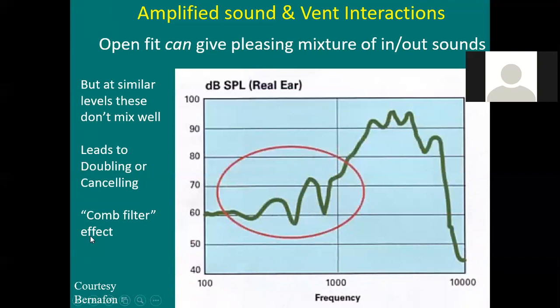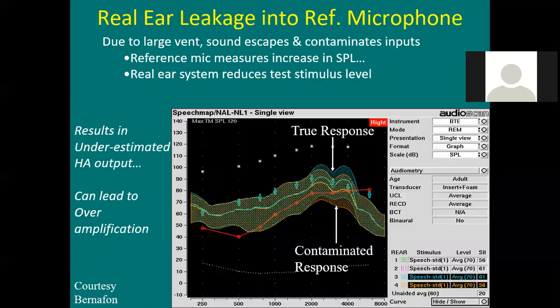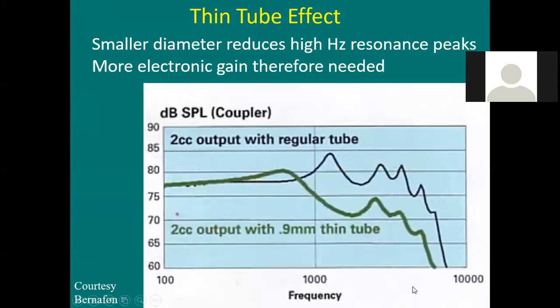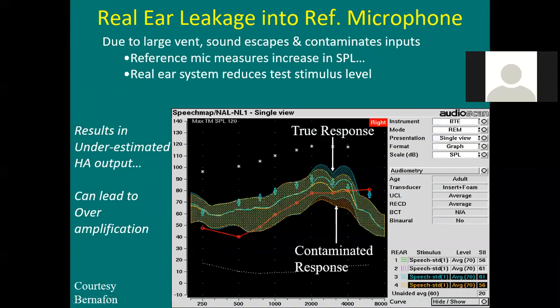And this can be a concern if you've got wide open vents. This is what one possible concern is. But when you're doing real ear, remember we were saying earlier that sound can leak out of your big vent and also get picked up by the reference mic. So watch what happens here. Due to large vent, sound escapes and contaminates the inputs.